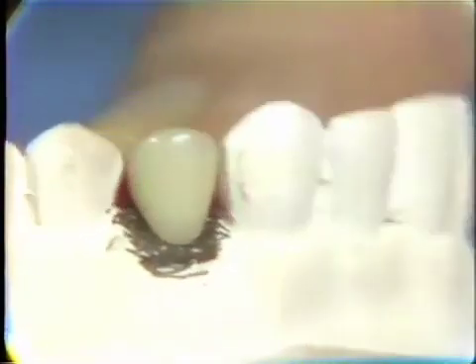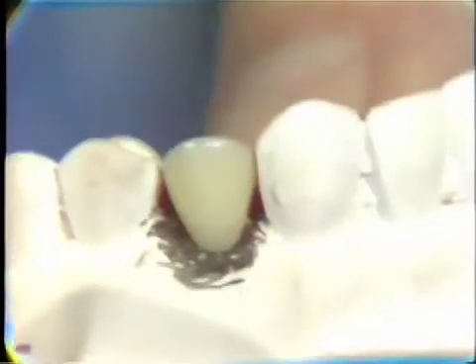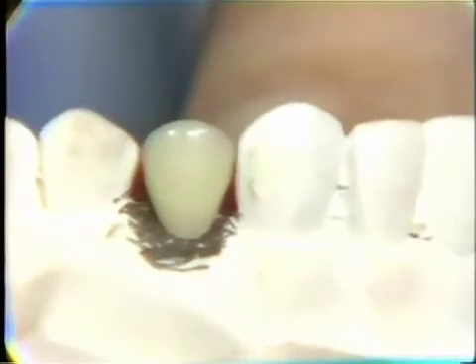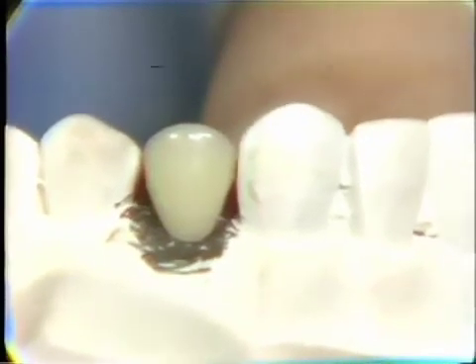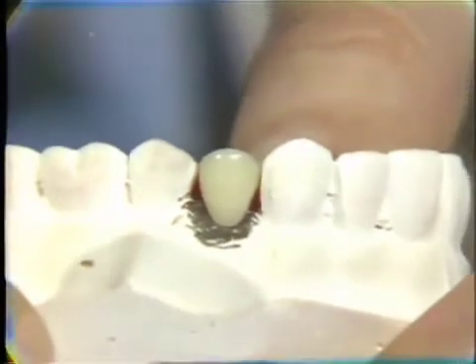I think I'm just going to turn the model around, and I think you can see as you look along the buccal that those embrasures are hidden in the normal view of this pontic, and you can open them without in any way affecting the aesthetic. But obviously that's going to be a much easier situation from the point of view of cleansing the margins of those retainers and of keeping the tissues there well stimulated and cleansed. So that then deals with the development of the proximal embrasures here.